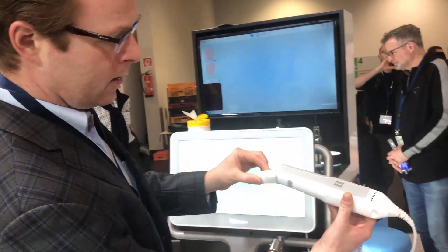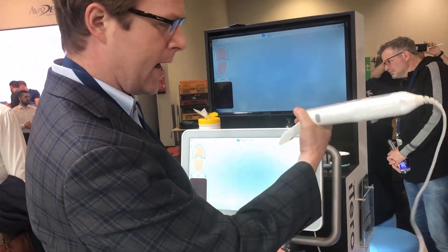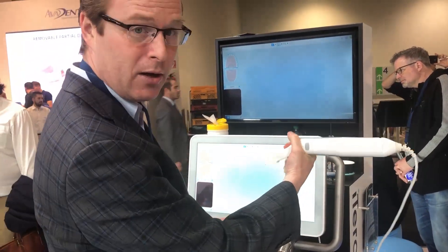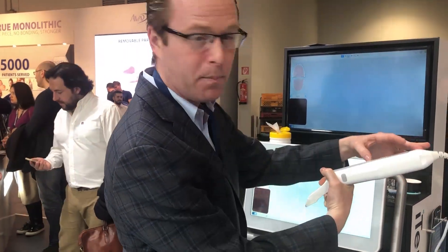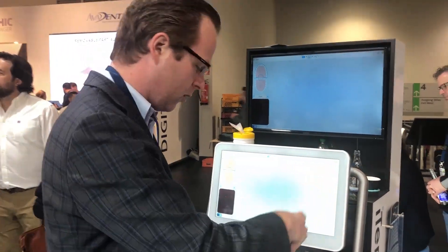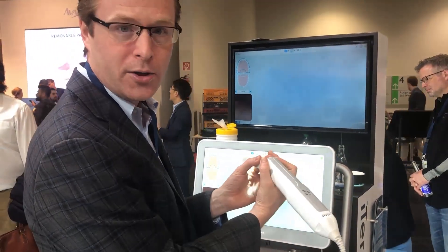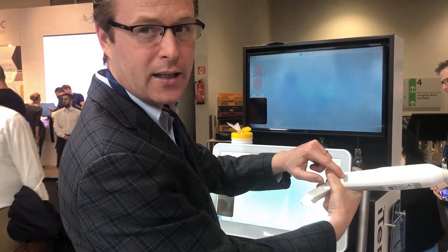So this is our wand, very similar to the Element and Element 2. They're intending you to hold it like this, but you can tell it's a little bit heavier on the backside — the processing material must be back here. The tendency is to want to grab it differently, but they claim you want to hold it like this. There's a side button right here to activate as well.